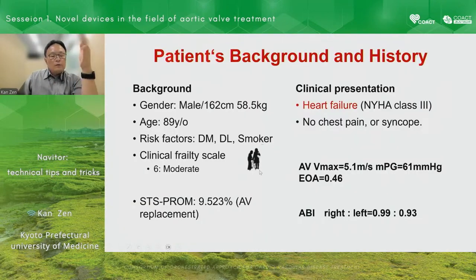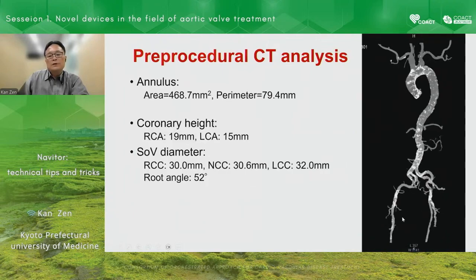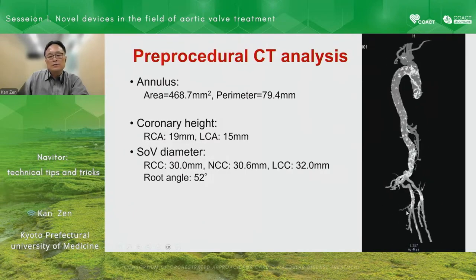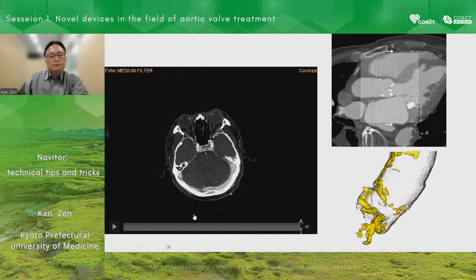Lastly, I want to show you the subclavian access case. From the 3D view, there is no chance to get access from the bilateral common femoral arteries of this patient. The left subclavian looks good.